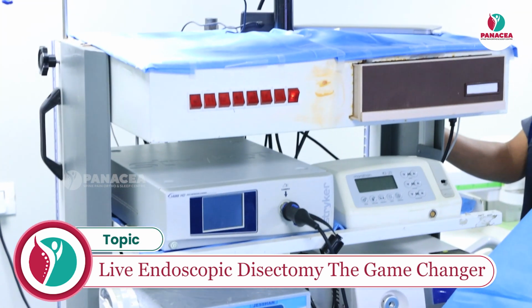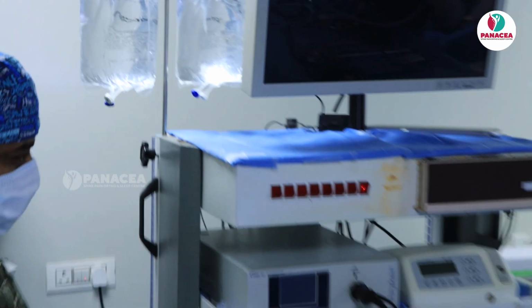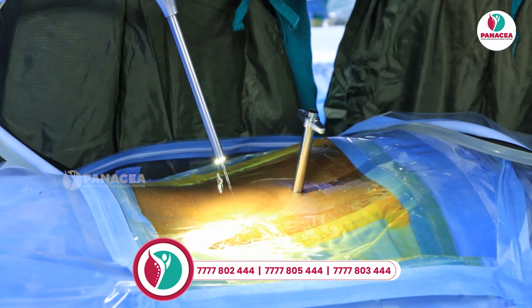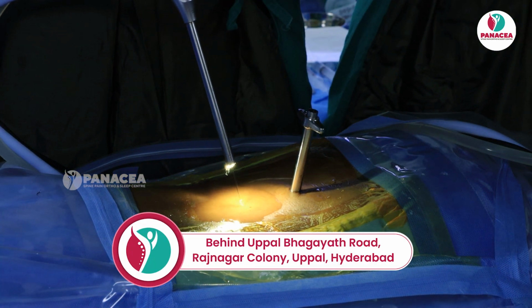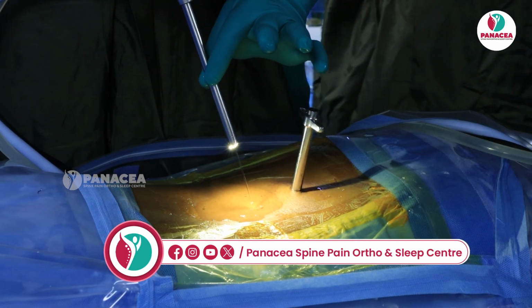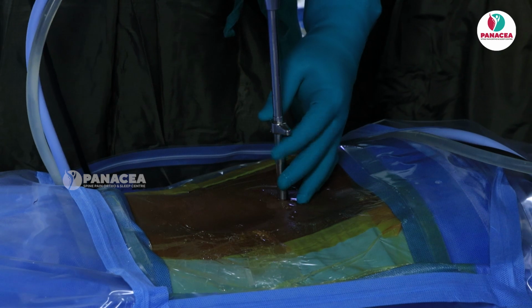At the same time, if you see here, these are the collapsible saline bags, 3 liters. Either we can do a gravity method or by pump we can do saline irrigation. Now you could see here the saline irrigation from the ingress channel. The same fluid will come out of the egress channel. This is the working channel. This is the obturator, the working sleeve, which has a diameter of 9 mm. The scope outer diameter is 8.2. You have 5.7 internal diameter for the working channel.